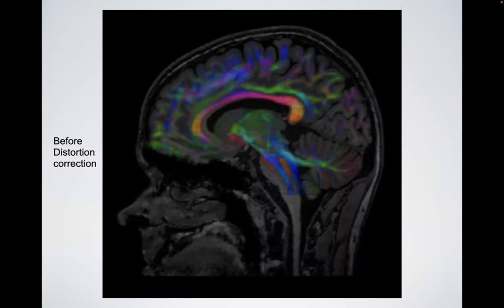And since in this summer school we want to infer brain functions, and Abib stressed the notion of anatomy, if we're going to put all these things together, we need a good registration with anatomy, and with the surface, and with the cortex, and with the deep structures, and with the brainstem. So this is probably the most critical step in diffusion. But it's doable, and we have good tools that do it now.